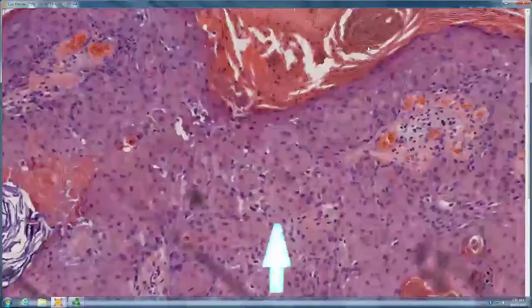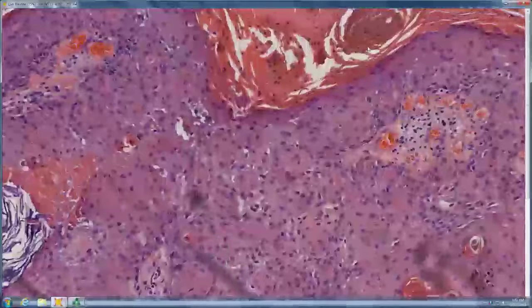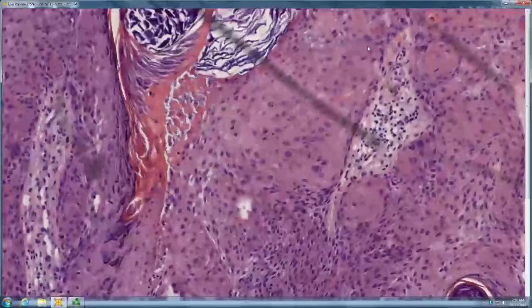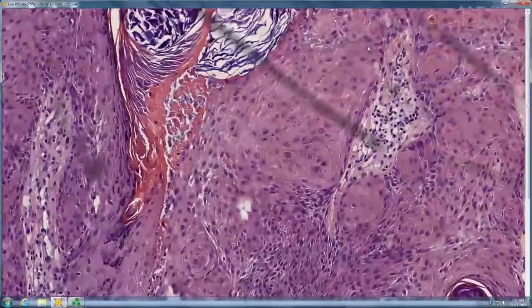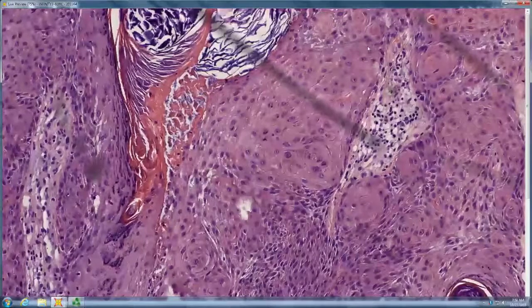Are there any squamous eddies? There are squamous eddies and pseudohorn cysts maybe, and spindling of keratinocytes. Irritated SK? So an irritated seb, what's the difference between an irritated and an inflamed seb? Inflamed seb has lymphocytes, right? Inflammatory cells. Whereas an irritated seb is like what happens when you put croton oil on a seb. It turns red, it gets squamous eddies, it gets spindling of keratinocytes, but there are really no inflammatory cells. And then you can have both. You can have one that's both irritated and inflamed.